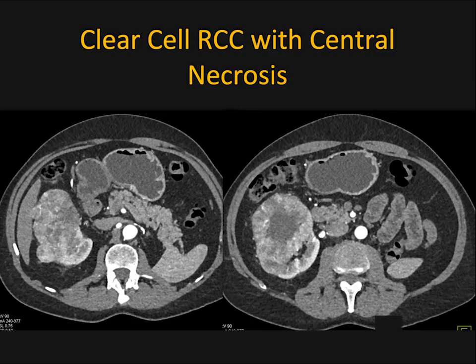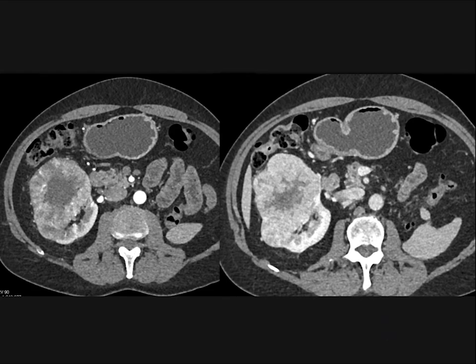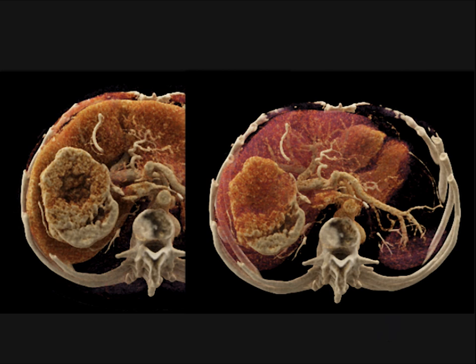We look at this renal mass as a hypervascular mass, obviously a renal cell carcinoma, but with the central necrosis and hypervascularity, we know it's a clear cell renal cell carcinoma, and recent articles suggest with central necrosis, these patients will do poorly. The neovascularity of tumor is very nicely shown on the MIP imaging. The washout showing as we go from hyper to relatively hypovascular mass. And again, the various appearances with cinematic. We are exploring what cinematic can provide.